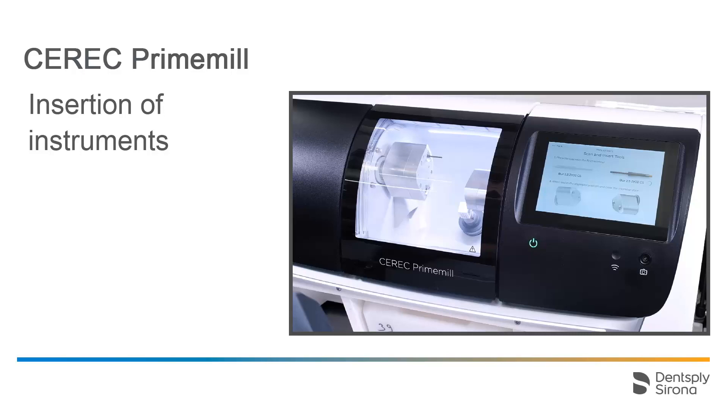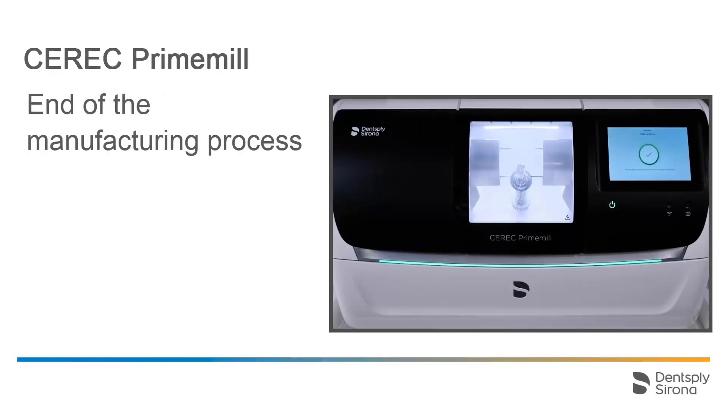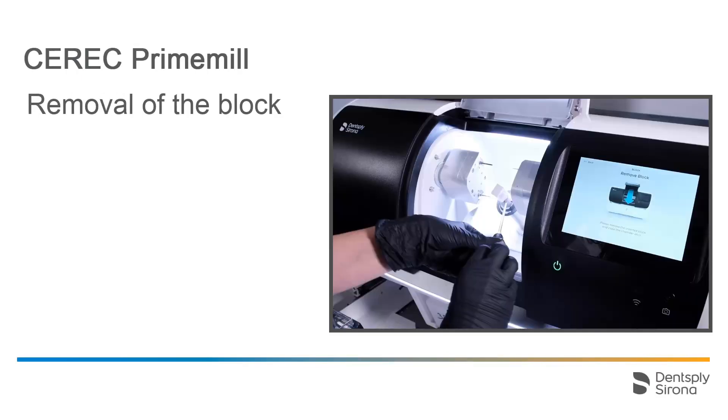At this point, we skip over the mounting of further instruments, the pre-touching process, and the manufacturing process of the restoration, and continue with removing the block after manufacturing. The completion of the manufacturing process is indicated by a green check mark on the touch interface, the bright green bar below the chamber, and the white light inside the chamber. To remove the block, we use the torque wrench again.